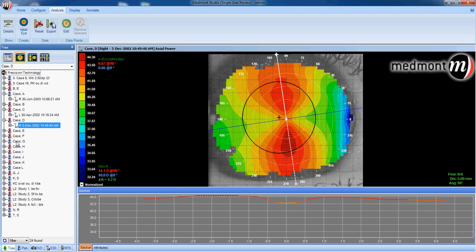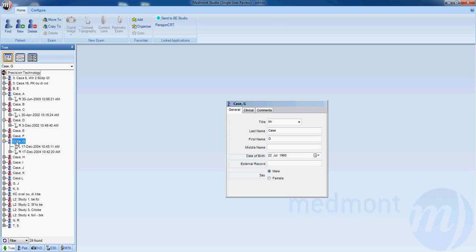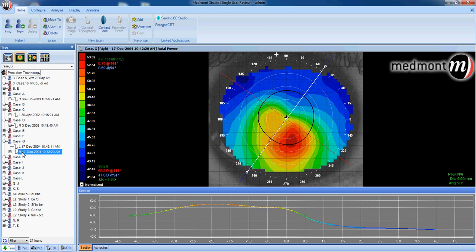For a keratoconic patient, you would see a map looking more like this, where we don't see a defined flat and steep meridian and we don't see a bow-tie shaped astigmatism. We see a typical ectasia where the steepest point of curvature is inferior of the apex.